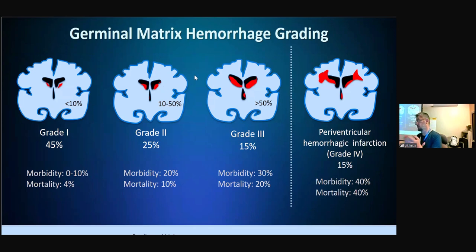The grading system was introduced 50 years ago, and it was based on CT. So they were not using ultrasound at that time. So it is very simple. It doesn't really fit all the cases we see today, but we are still using them. Papile introduced it, and then Volpe actually improved it in a different way.